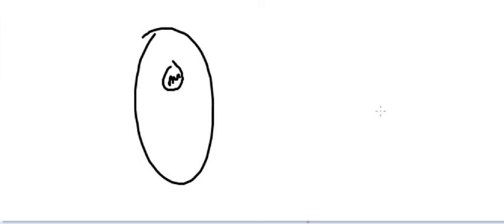Everything has its own number. I can know the number of this white thing. I just put my cursor here and the computer will tell me this is 600 Hounsfield unit. So this is something dense, something calcified. It's a stone.